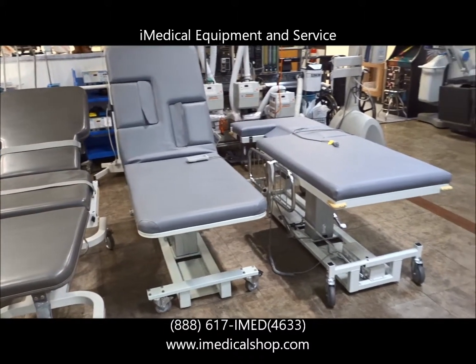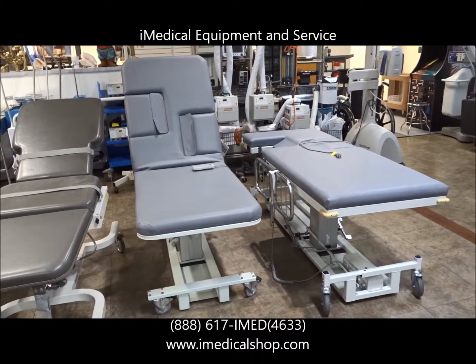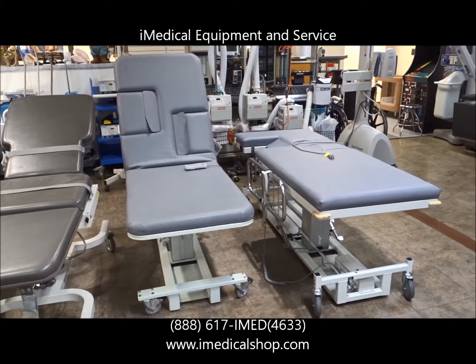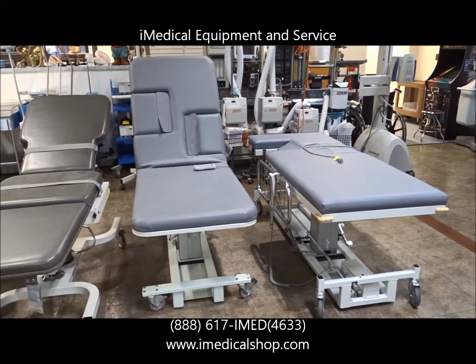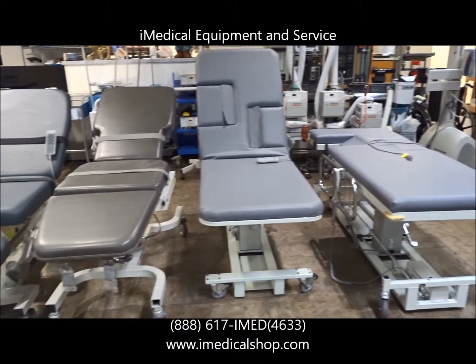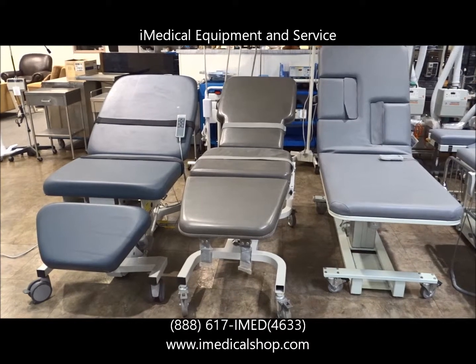And then we've got the MPI, which stands for Medical Positioning, Inc. MPI also sells very high-quality tables. We do carry some other models, but these are probably four of the most popular ones we've got, and they're going to service a very wide range of different types of ultrasound applications.